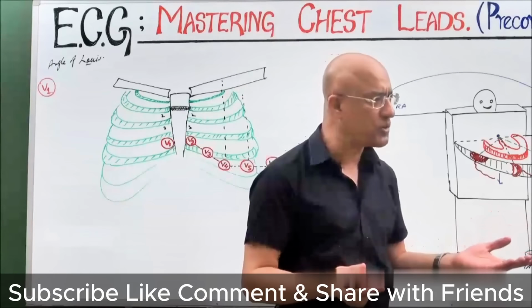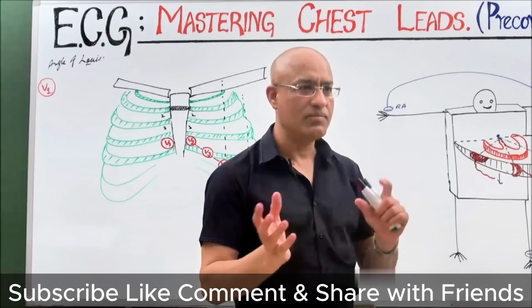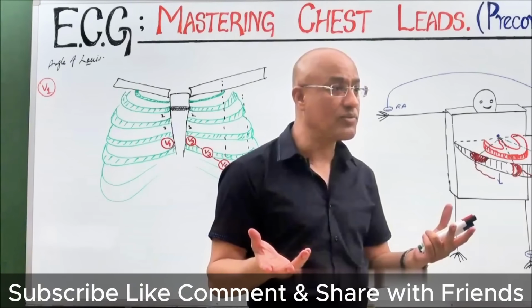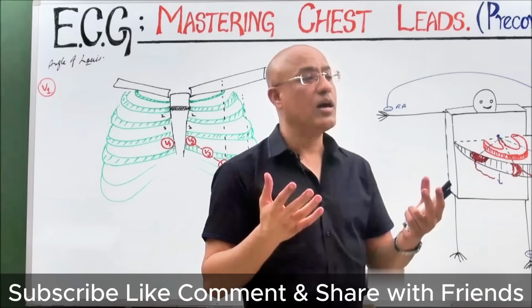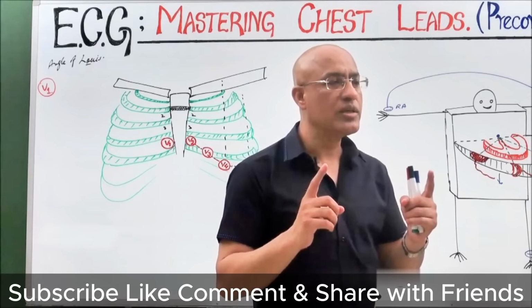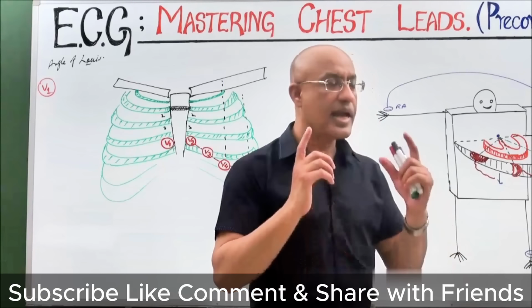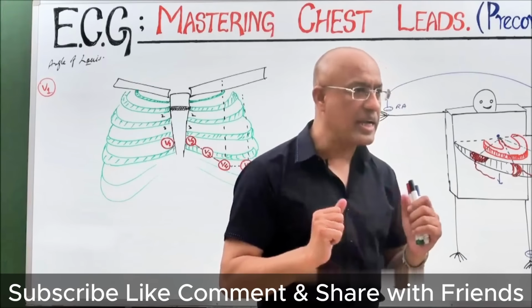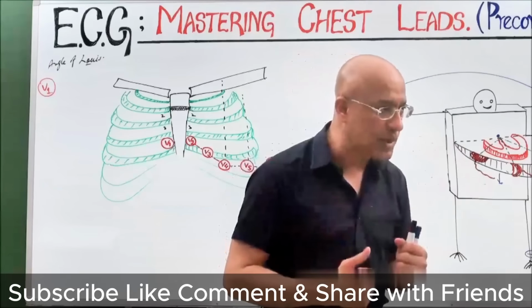And about females, their nipples change. In young females, they are a little upward, right? As number one. In females, nipple position depends a lot on the size and shape of the breast and the parity of the woman, how many children she has, and even the age of the woman.